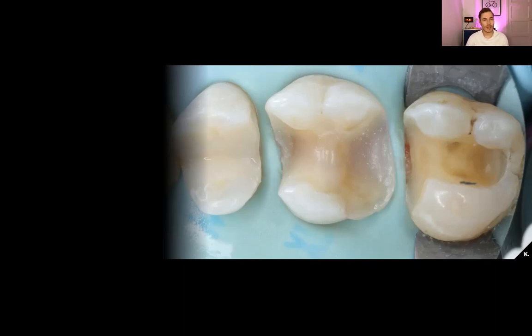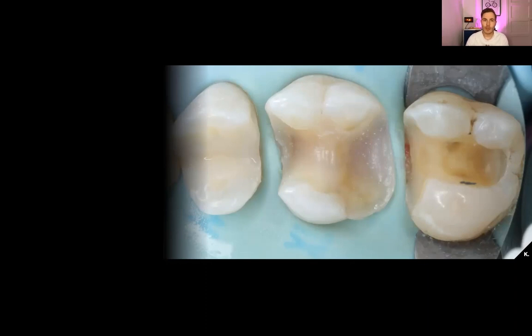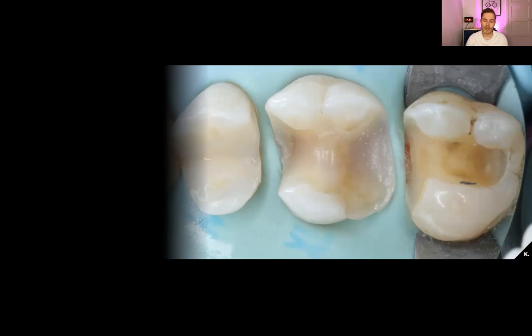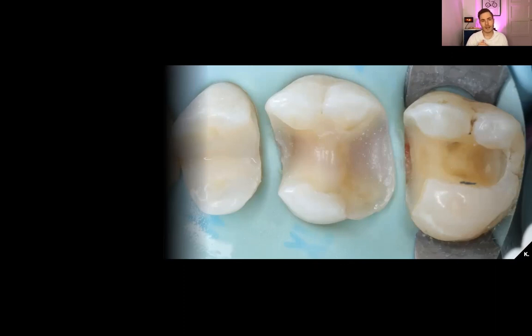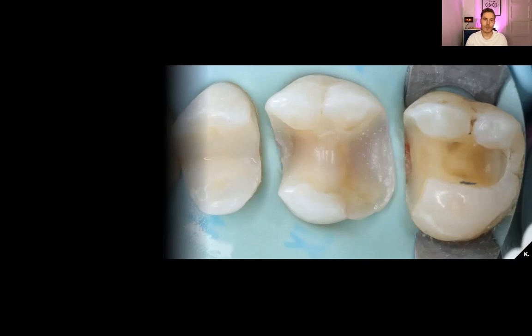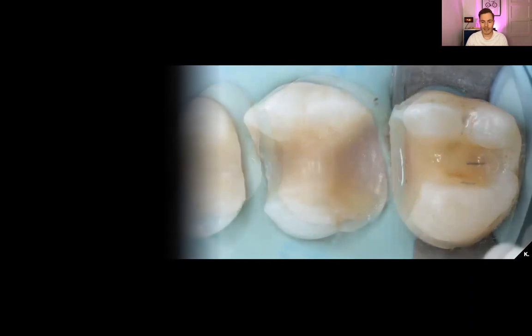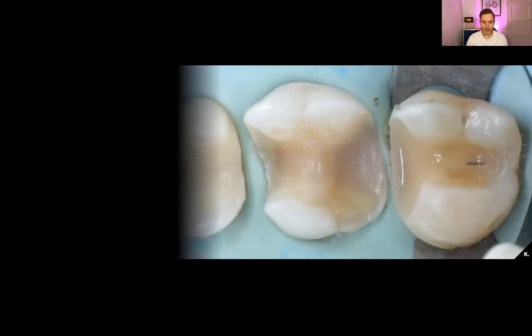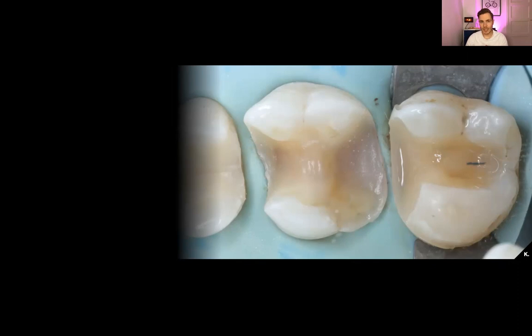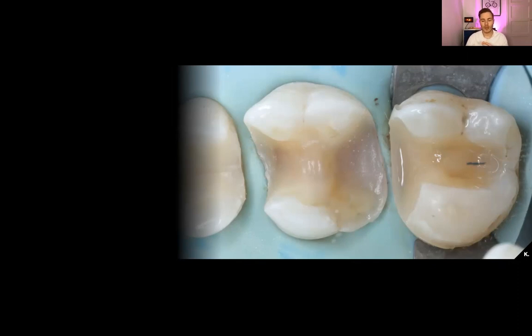The first molar is now done and I move on to the second molar, where we see the same problem — the outline is deep, lower than my rubber dam, and there's a little bit of contamination on the mesial side. I place my band over there, repeat the same process, and then it looks like this. I raised the margin a little bit, also using the same technique with the AquaCare, OptiBond FL, and Majesty Flow.